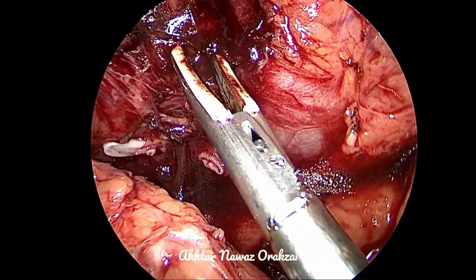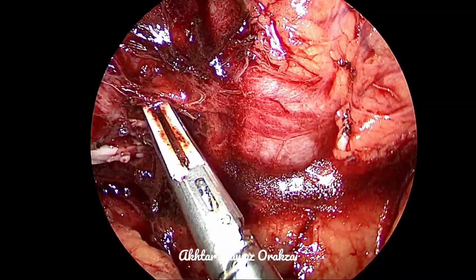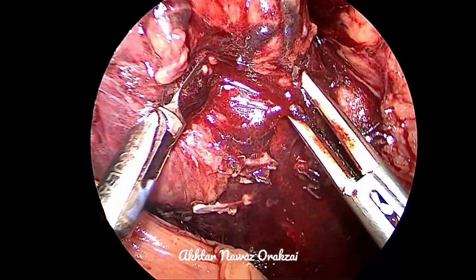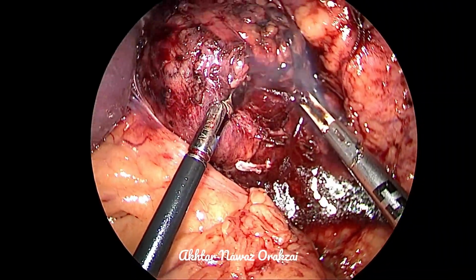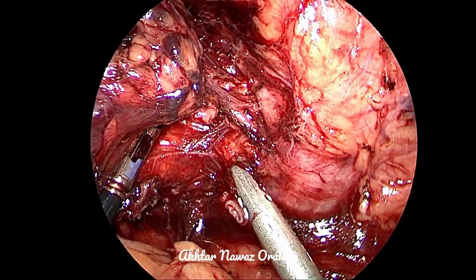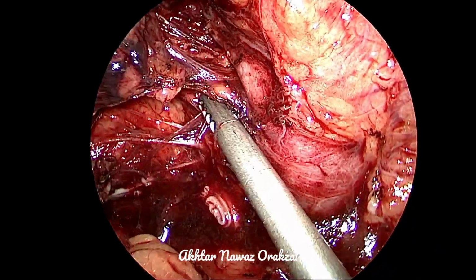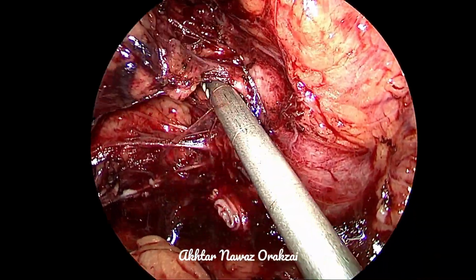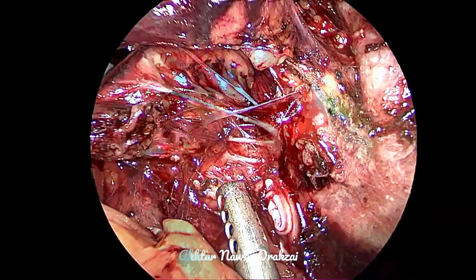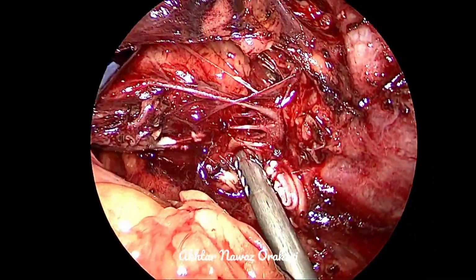But here we are very careful, because a movement in millimeters where it cannot be visualized, the artery can get injured. So take your time and try to dissect the adrenal gland away from the renal artery. Here you can see very clearly that we are dissecting the adrenal gland, holding it laterally, retracting it, and dissecting on the surface of the adrenal gland.